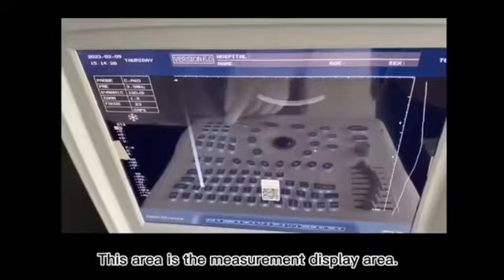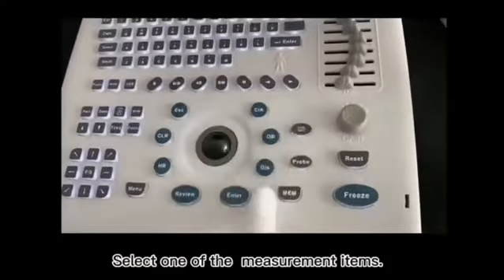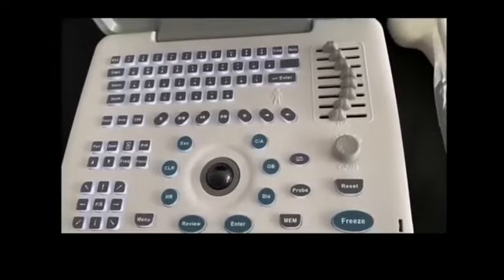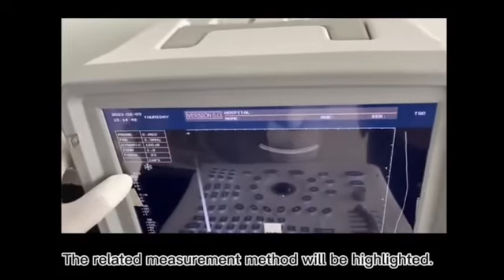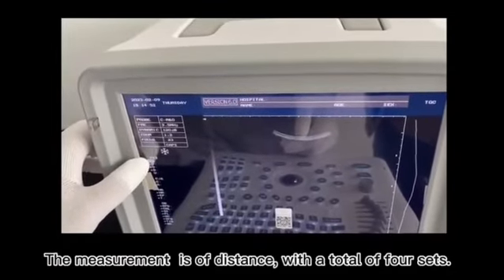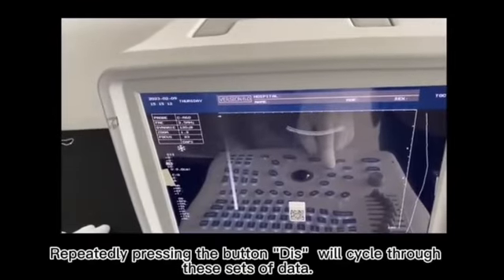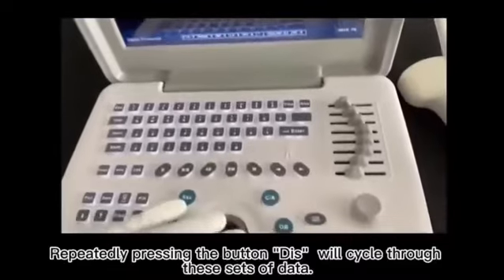This area is the measurement display area. Select one of the measurement items. The related measurement method will be highlighted. The measurement is of distance, with a total of 4 sets. Repeatedly pressing the button will cycle through these sets of data.